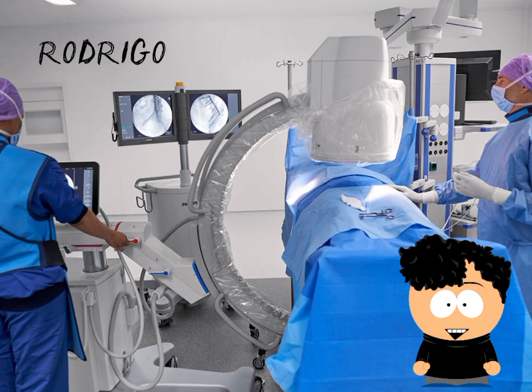Application of the equipment. Surgeries: C-arm X-ray equipment is commonly used in surgical procedures such as orthopedic surgery and vascular surgery. Interventional procedures: used in interventional procedures such as stent placement and tumor embolization. Diagnostic: also used to obtain high-quality diagnostic images of various parts of the body.